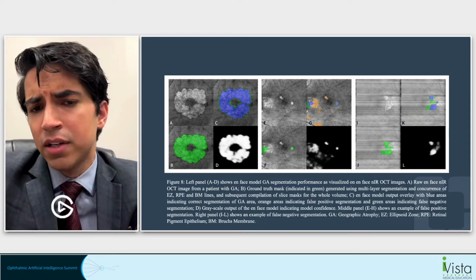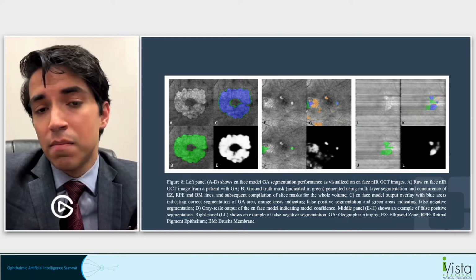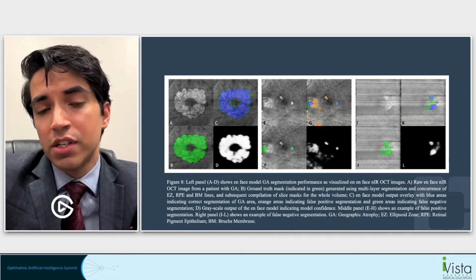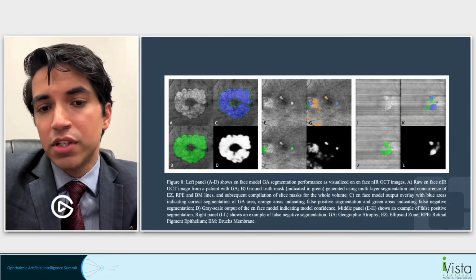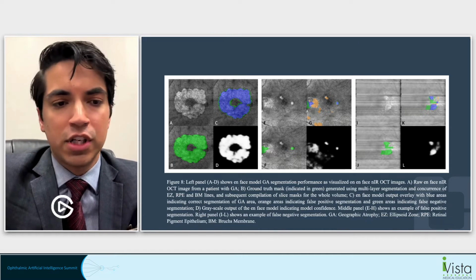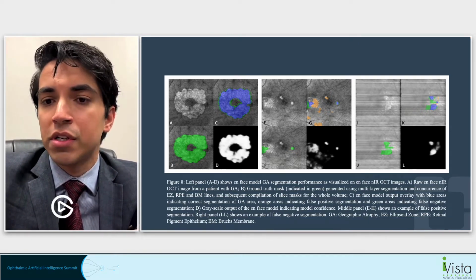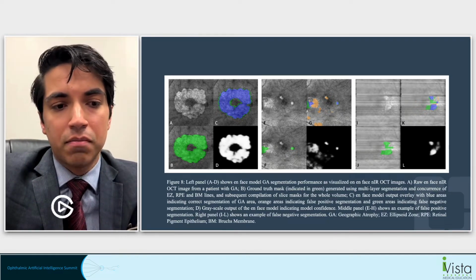In the right panel, you may notice that in scans which have artifacts, or horizontal aberrations in the image, the GA lesion itself is not as contrasty and easy to identify. The model tends to undermark a little bit in such images. So it really boils down to the quality of the input images that go into the study, and then you are able to achieve higher performance.